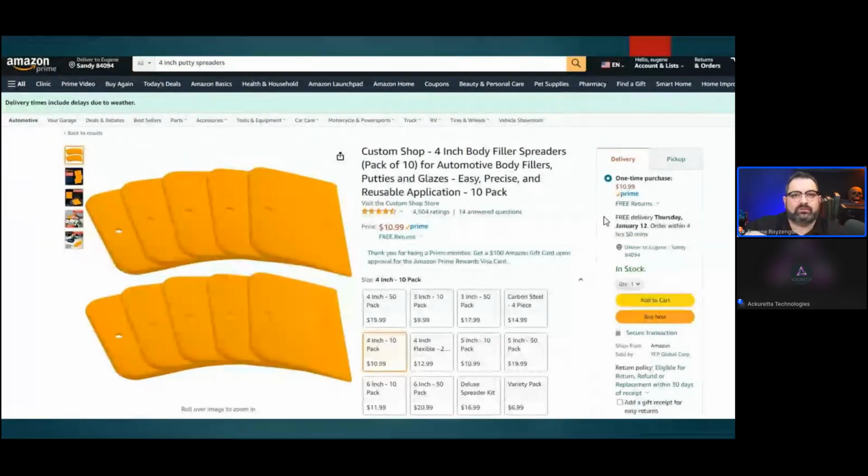because it's a matrix, right? And there's a filler inside that matrix that gives it strength and everything else. So the filler will settle and the matrix will stay on top, and you want to make sure you spread it all the way through, otherwise you get failed prints. So I'll mix it in there, and once it's dirty, I'll just throw it in my CLEANI, and when I clean my prints, it just cleans it for me.